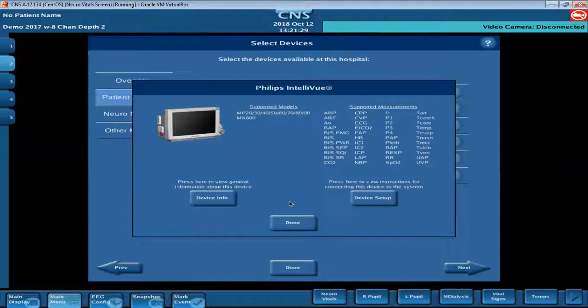So I think if your hospital is using a label that's not on this list, this is also an opportunity for you to communicate back to the company and tell them, hey, this has become a trend in our unit to monitor this, or we wanted to do this, which one would you recommend? I think this list is really nice. You can just take a screenshot or a snapshot of this, and again, I would go back to the research application. If you think you want one of these parameters later, even if you don't display it, these may be things you want to enable later, because some of these are just calculated values. Some of these are actually collected values. So they may be helpful to have.